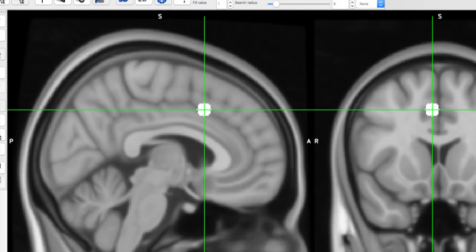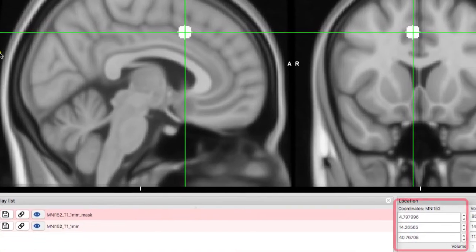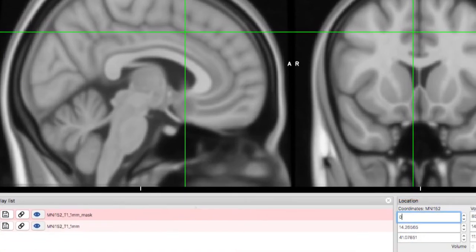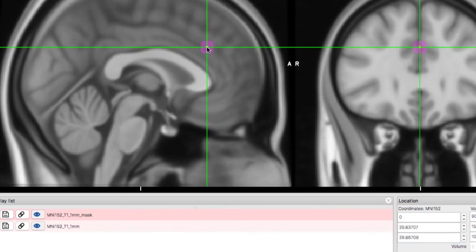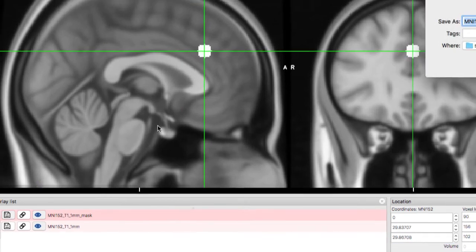You could also input the coordinates of the peak activity from another study, click in the center of the crosshair, and then fill the voxels. You can save the ROI by clicking on the Disk button.